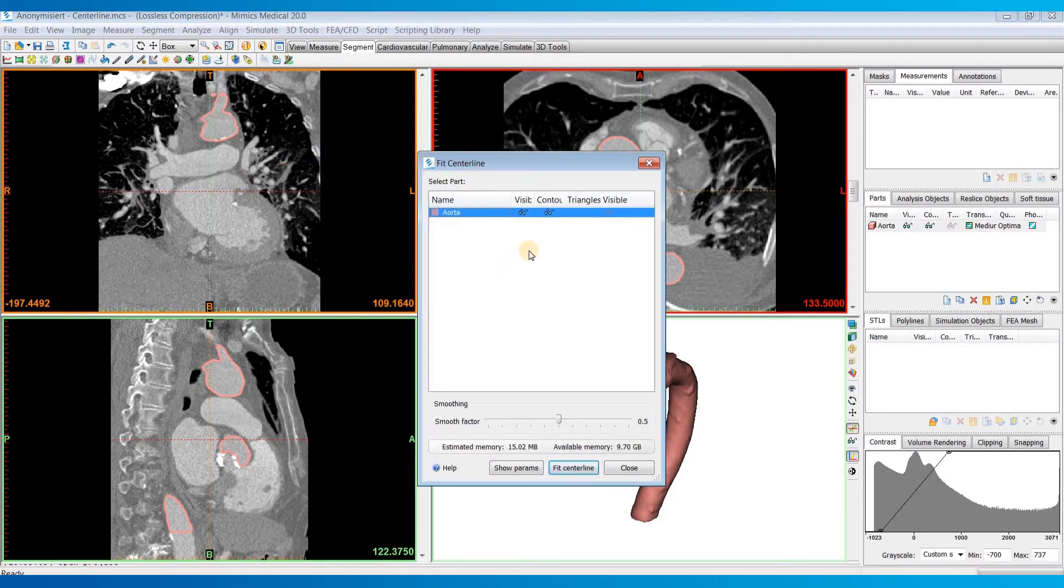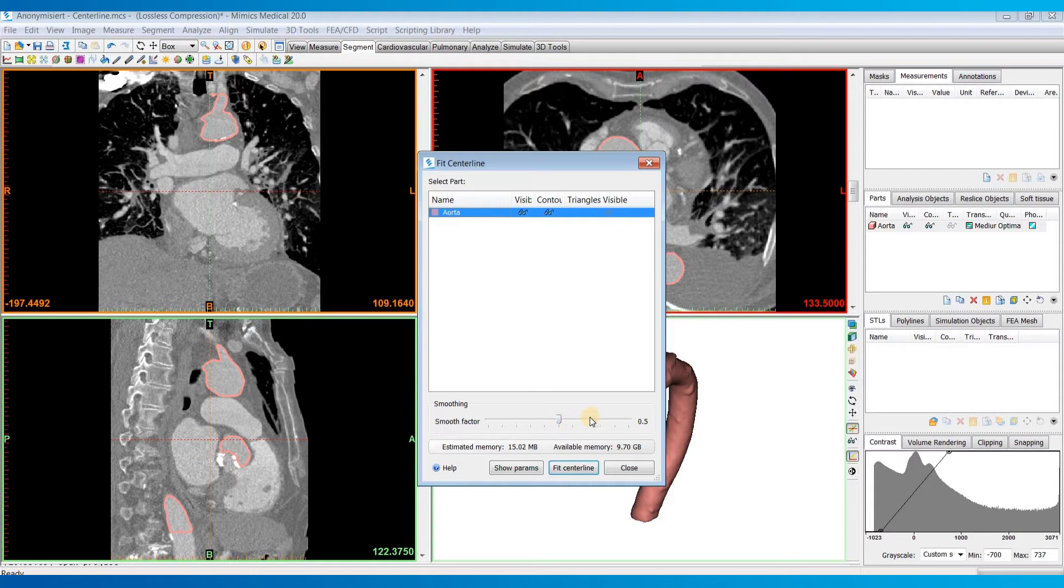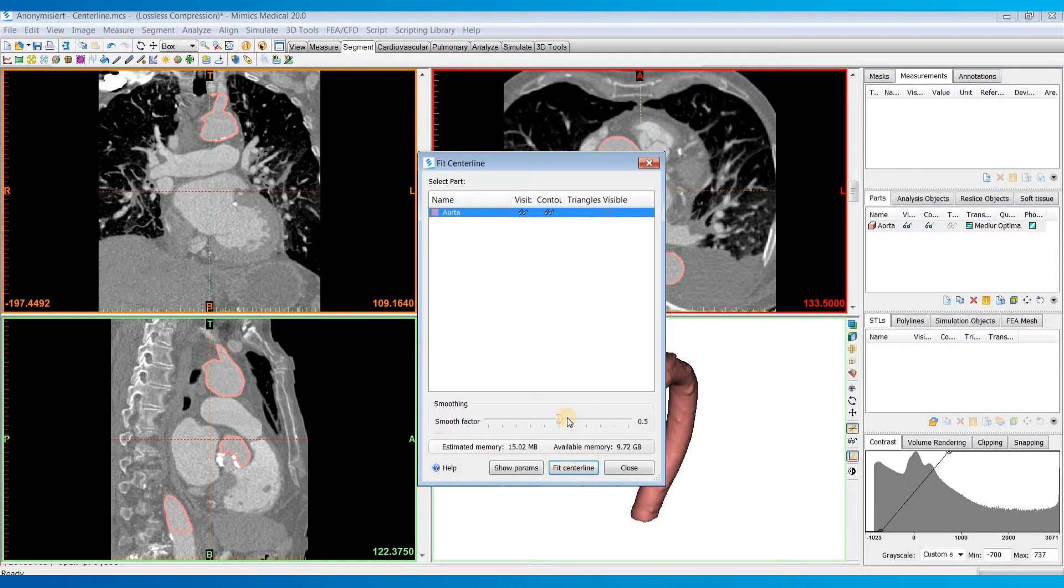Now there's only a few parameters for this tool. First is the Smooth Factor, which controls the level of smoothing performed. And smoothing will stop when one point in the centerline branch deviates from its original position more than the Smooth Factor times the average branch radius.